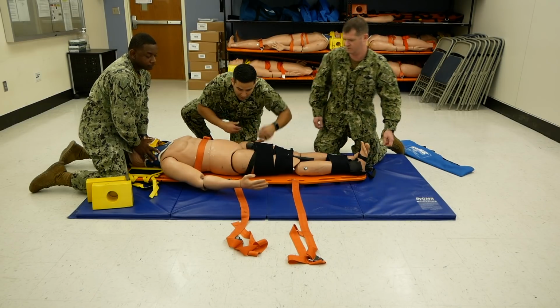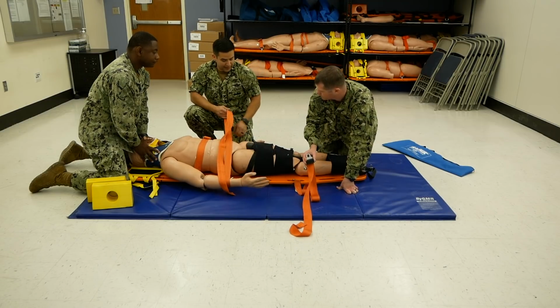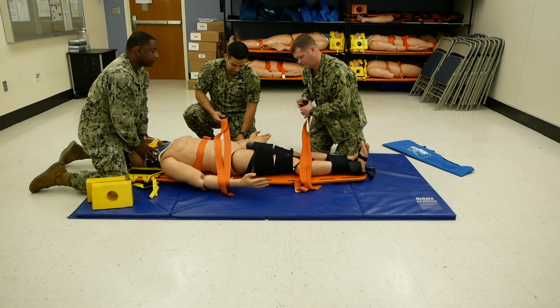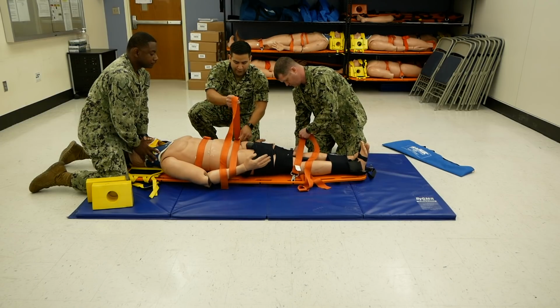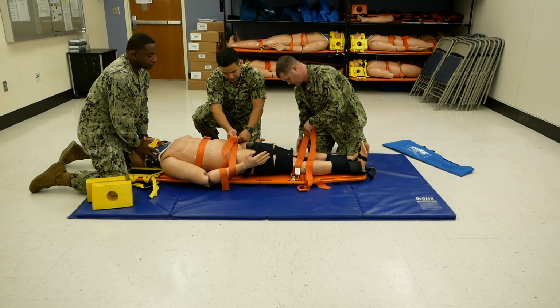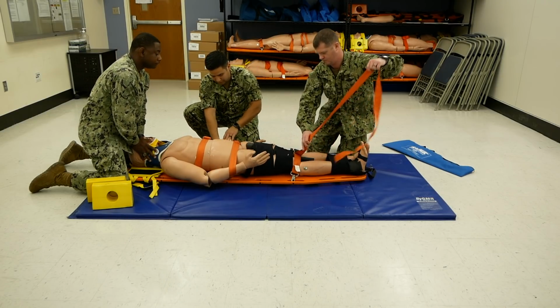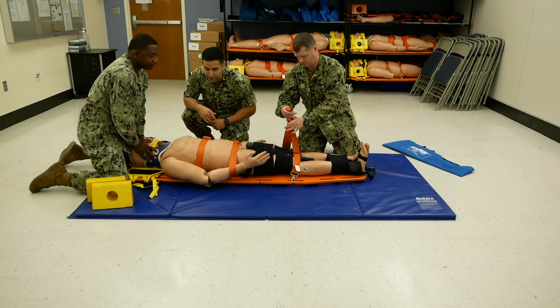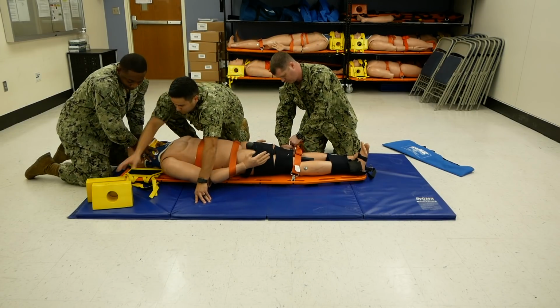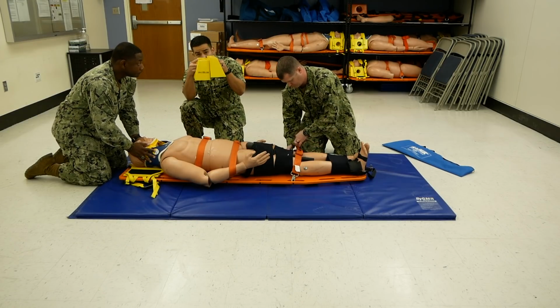Second strap goes around the arms. Assistant, can you please secure the lower extremities? Feed and pull technique, feed and pull. Finally, we move on to the head blocks. Make sure the head blocks are 90 to 90.